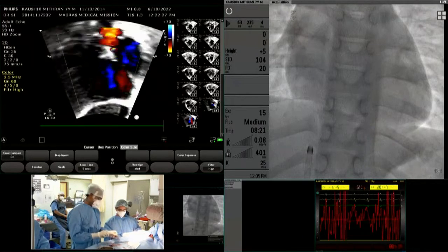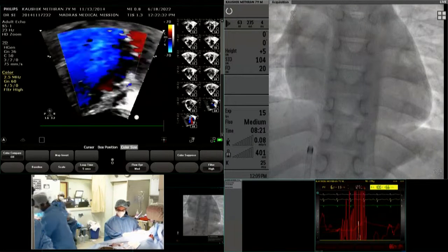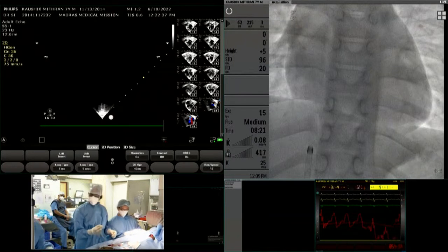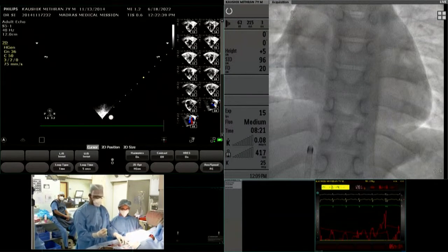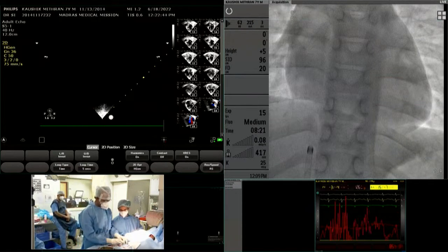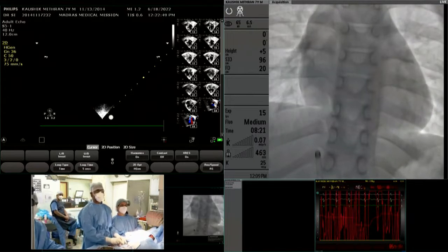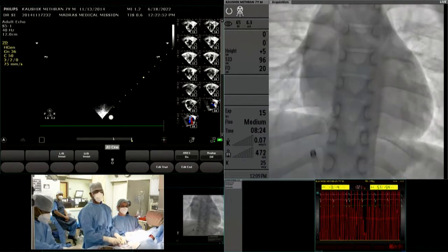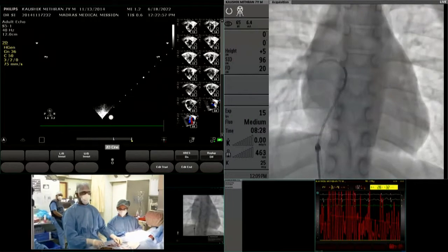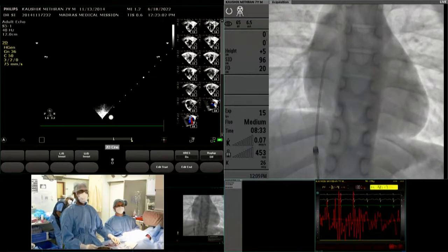Sir, as Dr. Jayarangnath was saying, actually, the conventional approach. A traditional pediatric cardiologist will immediately think about one and a half ventricle repair. Yes, sir. Now, that does not mean every patient whose right ventricle should be condemned as only suitable for one and a half ventricle repair. Yes, sir, got that. So there should be a way of analyzing. So I'm saying if there are additional defects, we have to go and properly cross. Right. Let us now try to cross it correctly.